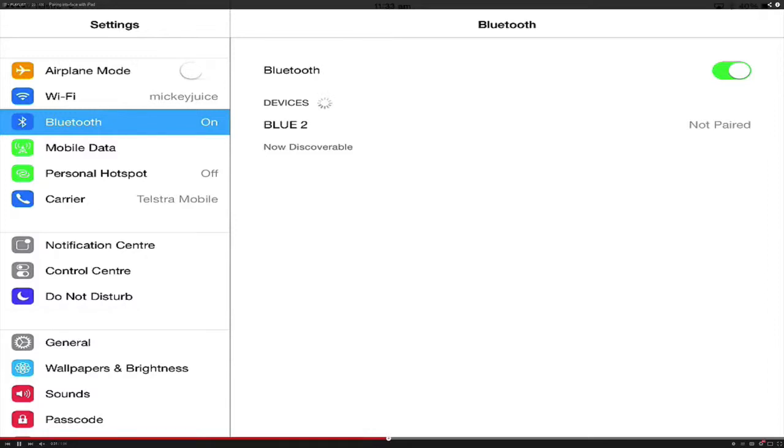You can see I have a Bluetooth switch interface that it's looking for, but in this case you'd be looking for the Connect case to come up as listed under the devices there. This is a slightly different example, but you would see Connect come up and then you would tap on it, and you would also see Connected, as you can see with the Bluetooth there. So look for the Connect case and tap on it for it to pair, and look for the Connected indication, and you know you're ready to go.